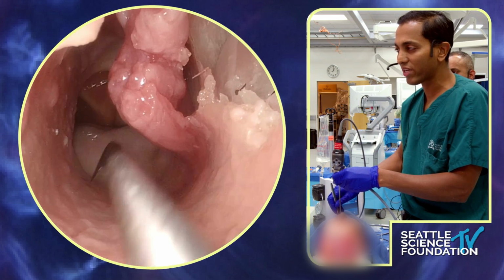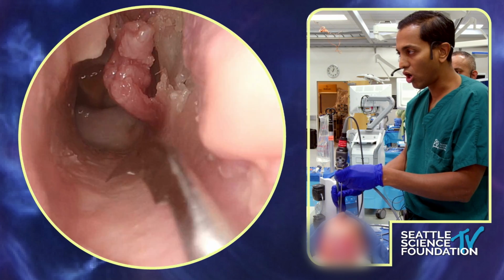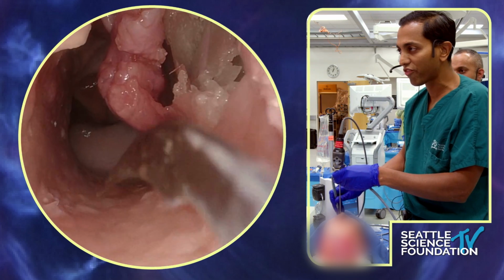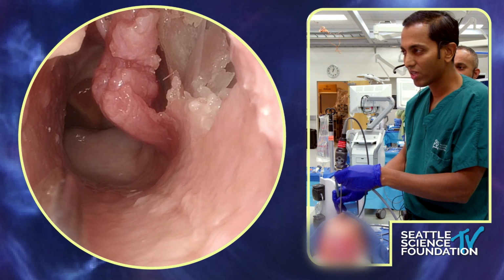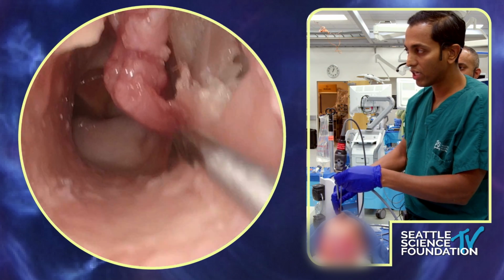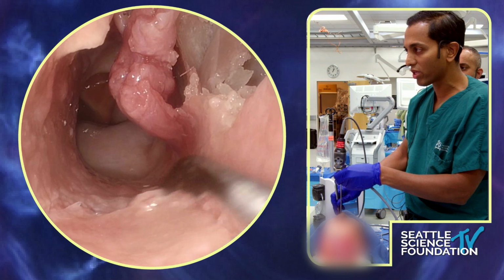If you get back there, you'll get into tissue that you don't want. But anywhere on this hard palate bone, you can come all the way until you get to this premaxillary tissue. So you can go all the way up to here, anywhere size-wise that you want from a free graft standpoint. For ease, we'll just go here. The palate mucosa is always a little bit tricky in these cadavers, but essentially you want to come through here. If you have a needle-tip Bovie, nice. Otherwise, Beaver blades work really well.